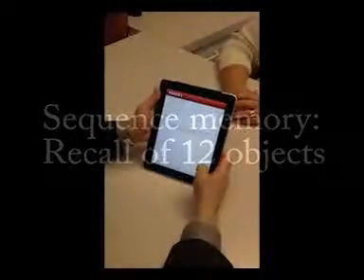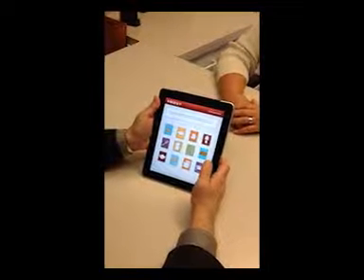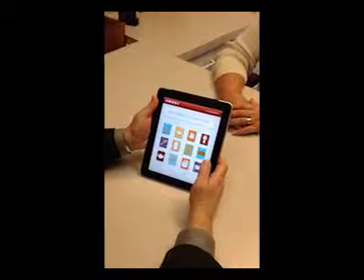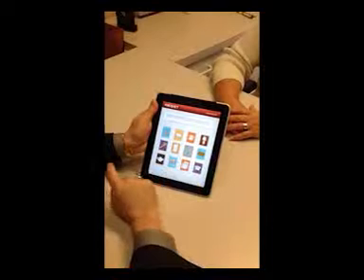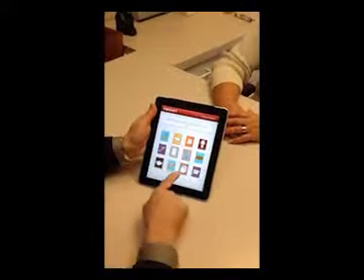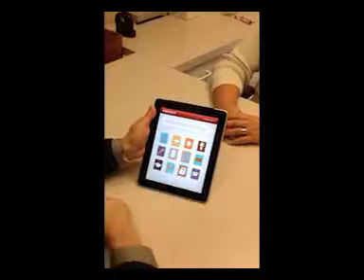Now, after she names all of the items, I turn the iPad back to myself because we're going to the memory section. Julie, I just showed you a variety of pictures of objects around the house. Now I want to see how many you can remember in any order. Okay. Teapot, broom, refrigerator, stove. Now, I press each one to lock it in. If it turns out that I pressed the wrong thing, I simply have to undo it, and I can lock it back in again. And that's all there is to scoring this.